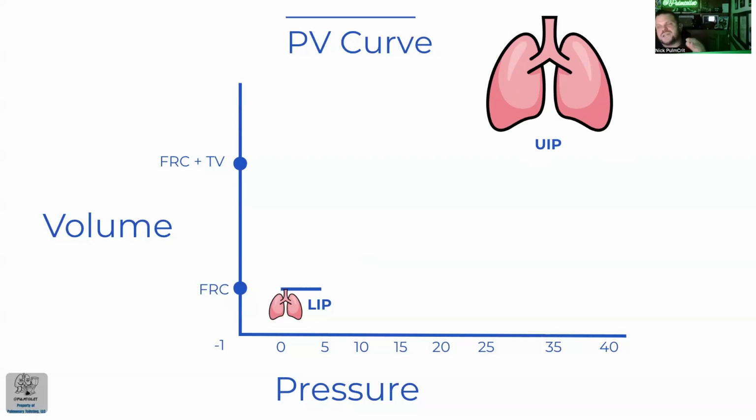This concept of volutrauma and barotrauma is a little bit confusing, because depending on the compliance, you can give a big volume, which some would say causes volutrauma. But if you have amazing compliance, like emphysema, and you gave a 10, 11, 12 cc breath, you might not have a high plateau pressure. ARMA gave big volumes, right? They allowed plateau pressures up to like 40, which certainly causes barotrauma. The question is, at what level of tidal volume, if you're not having high airway pressures, is volutrauma? I think the literature would say somewhere between 10 to 12.